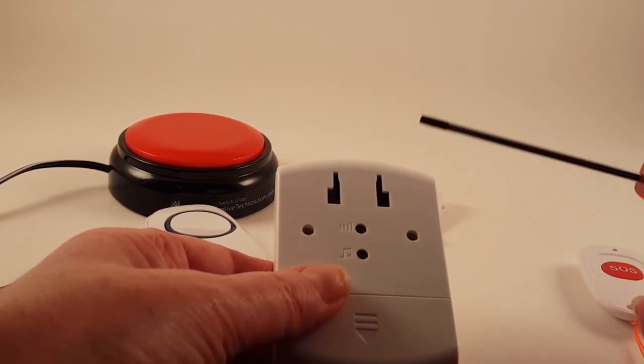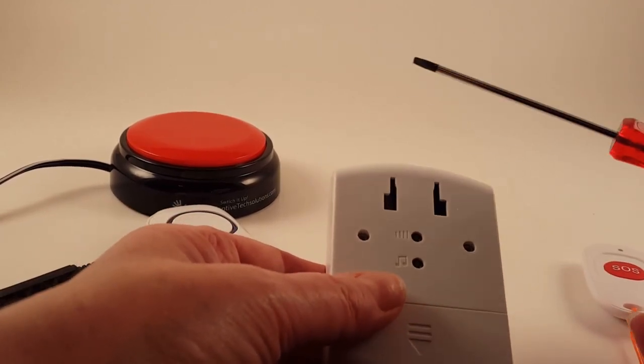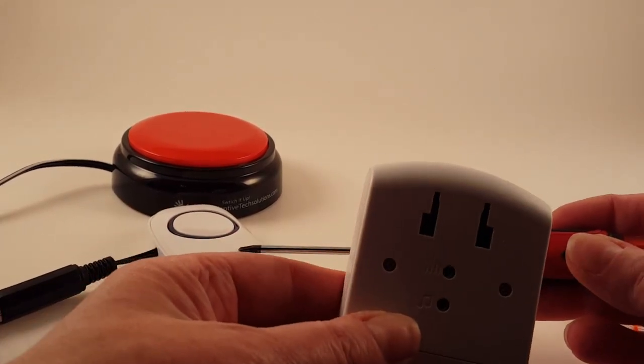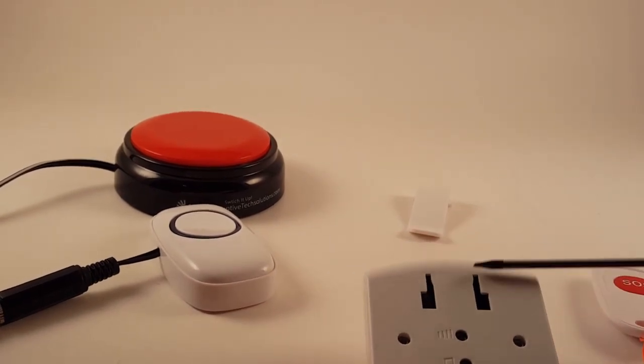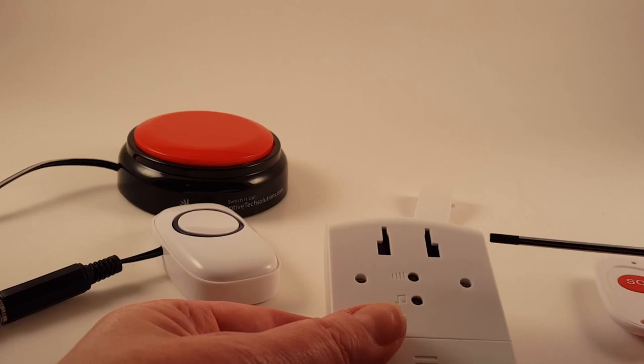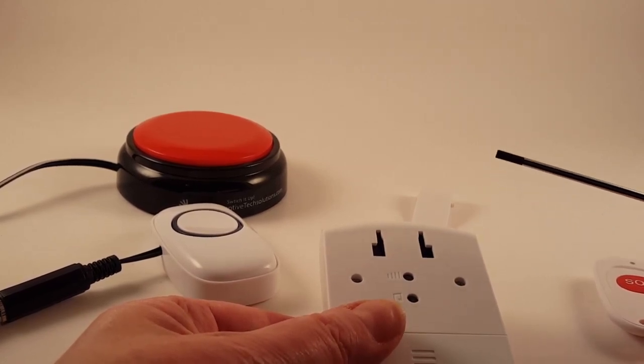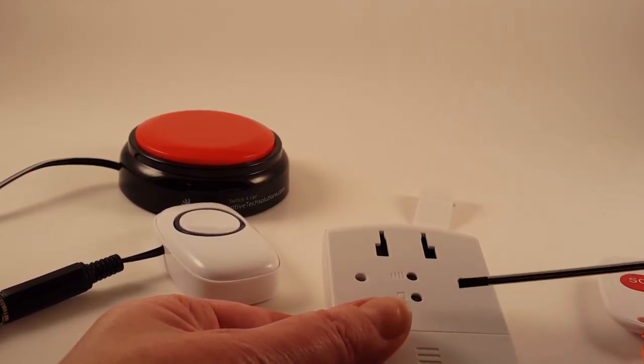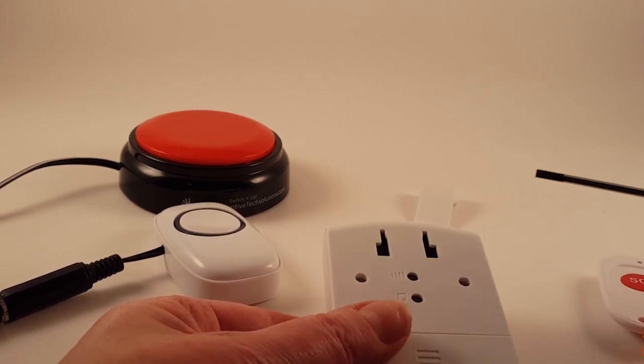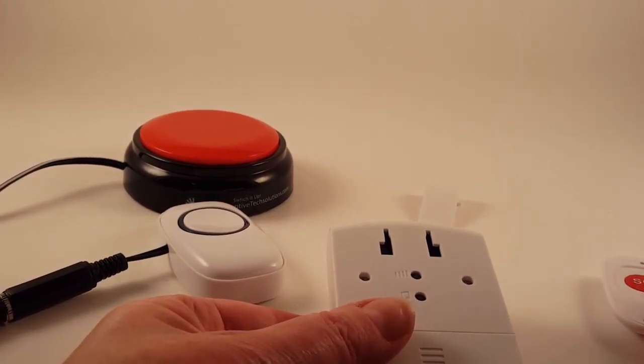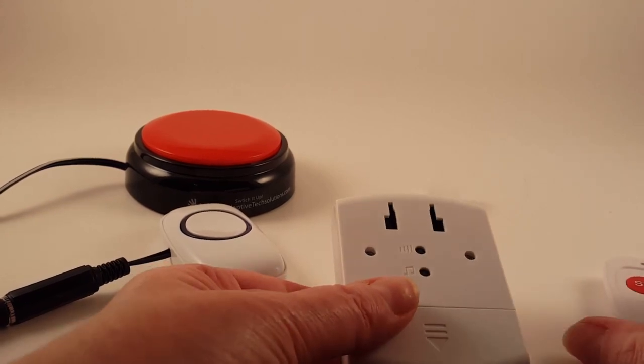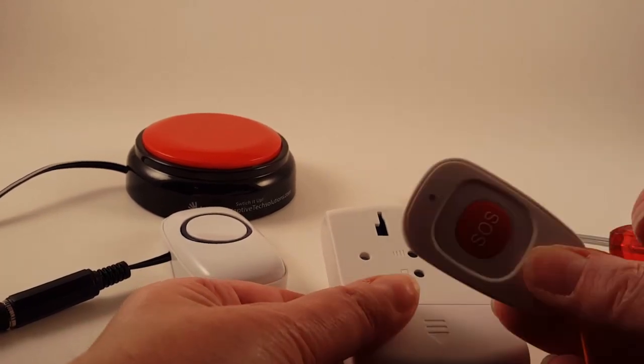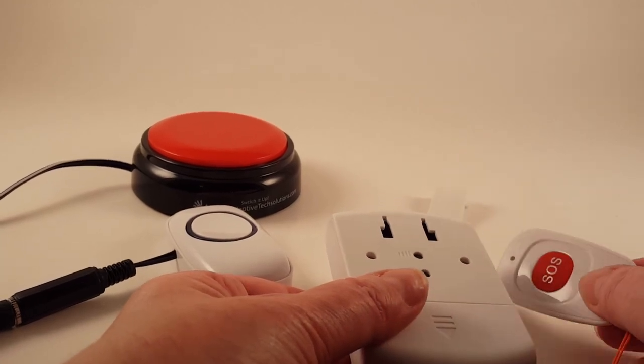One thing that's really neat about this particular model is that you can pair up a lot of different transmitters to this, so if you have multiple users within an environment, you can have different people with different transmitters, and you can assign different chimes to those transmitters so that you'll know if you get a certain tone that it's a certain person that's needing your assistance. Same thing with this. When you pair this up, it also is something that you would assign a chime for.